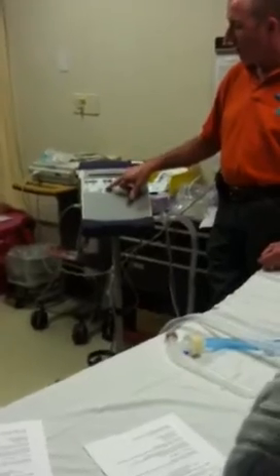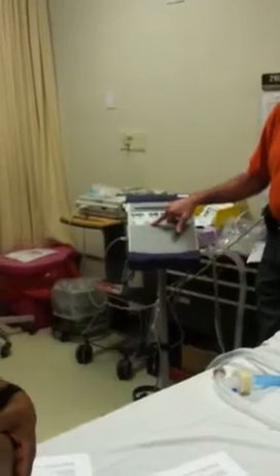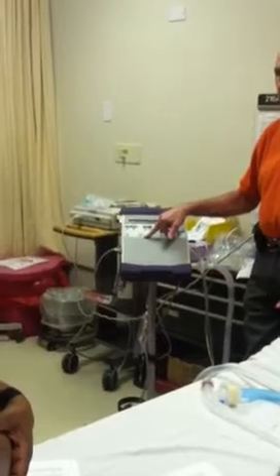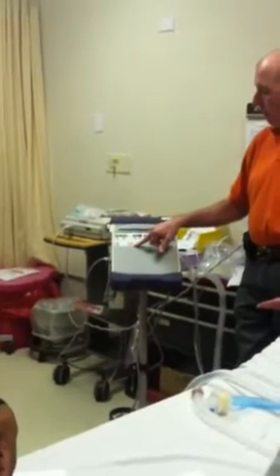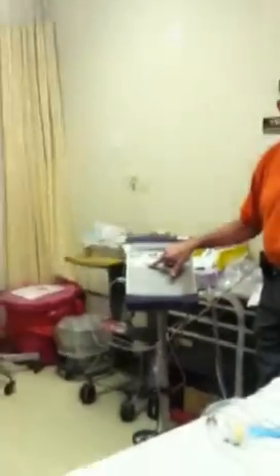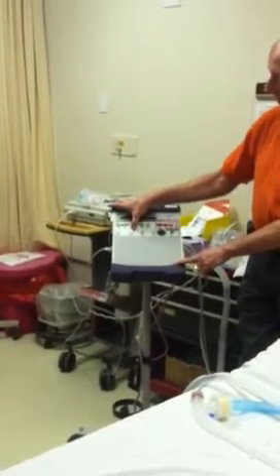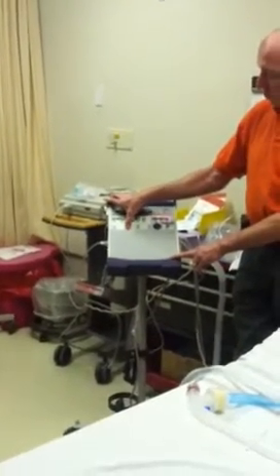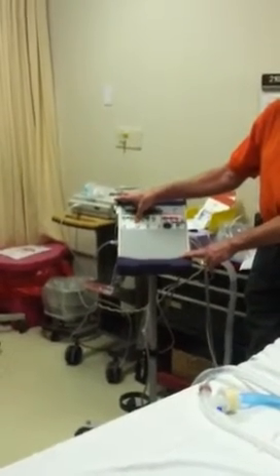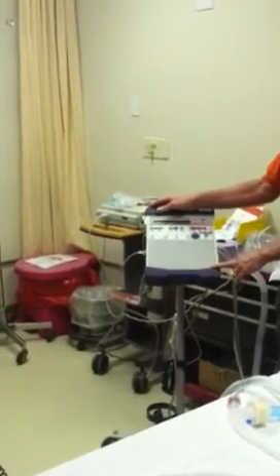Okay, the next control you need to know about here. Whatever control they come over here in, whether they're in assist control or if they're in SIMV, which means they're taking spontaneous breaths, they're probably going to remain in that control. But if by chance you ever had to change it, you would hit this twice, and it would go to the other side. Now we're in SIMV. Now if I want to go back to assist control, they're not breathing on their own, the doctor wants the machine to do all the breaths, then we'd switch it back over from SIMV.